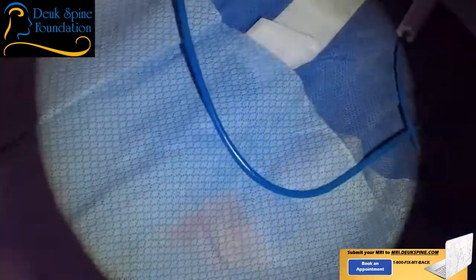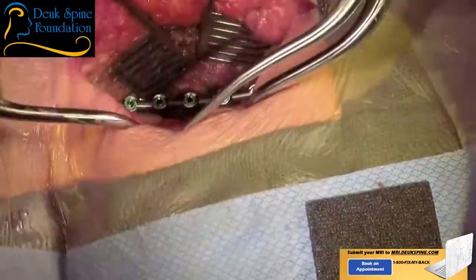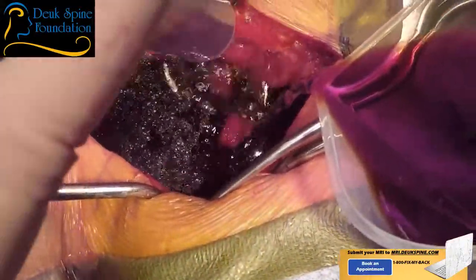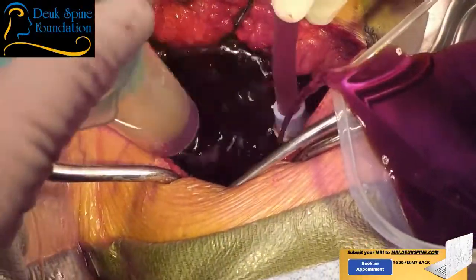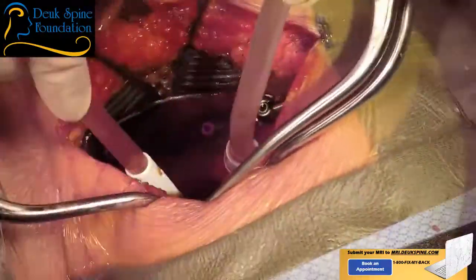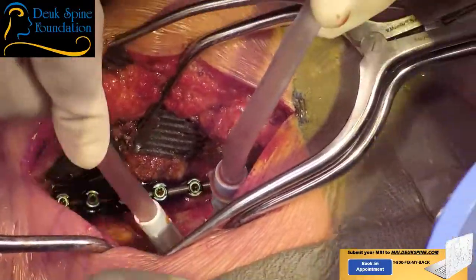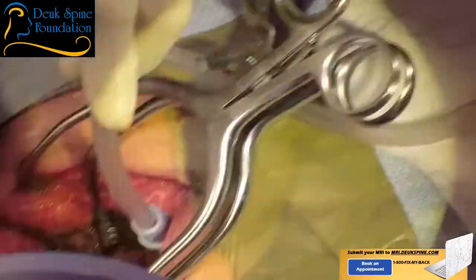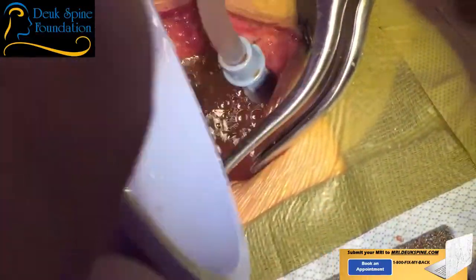I think I already got that one. We're good, yeah. Irrigation. We'll probably need a few gel foams after I'm done. So we usually irrigate with betadine, folks. Why? Because NASA developed it. It's really good at killing pretty much everything. Viruses, bacteria, protozoan, fungus. It's the universal sanitizer. So we used to do bacitracin and saline, but then I guess they decided bacitracin is not necessary anymore in surgical irrigation. Did you know that? I was doing it for 24 years, and then I just changed last year because of those papers that came out saying there's no benefit to adding bacitracin.